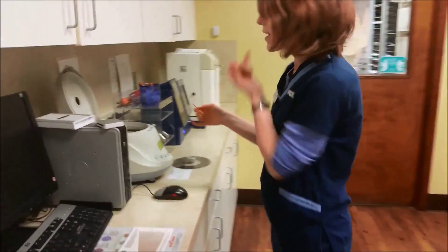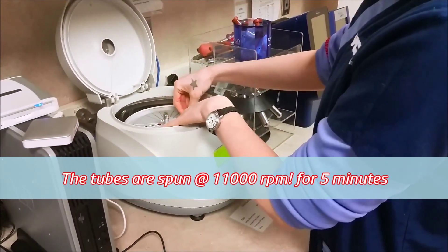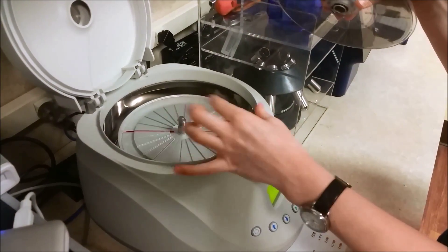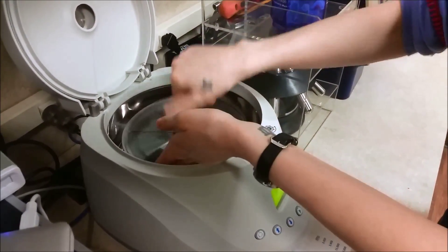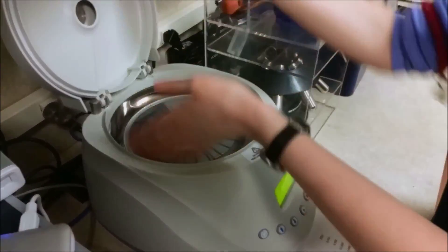All right, so our tubes are full. Now I'm going to place it in the centrifuge. This will basically spin the blood down so that the red blood cells are packed on one end, and that will tell us what percentage it is.